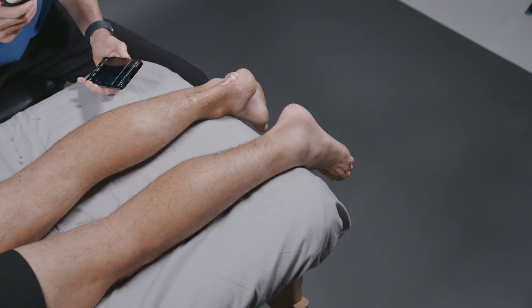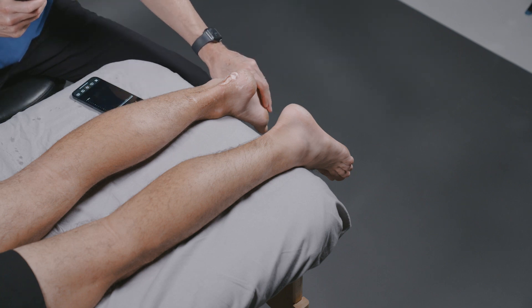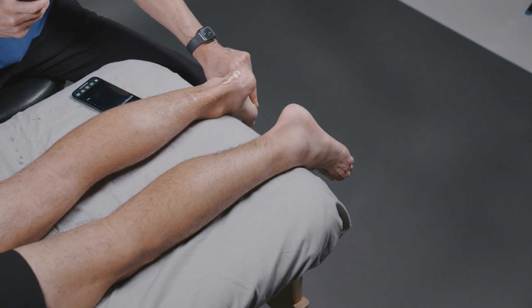To do the examination, you would typically place the patient in the prone position and hang his foot off the edge of the bed. This will allow you the ability to dorsiflex and plantar flex the foot.